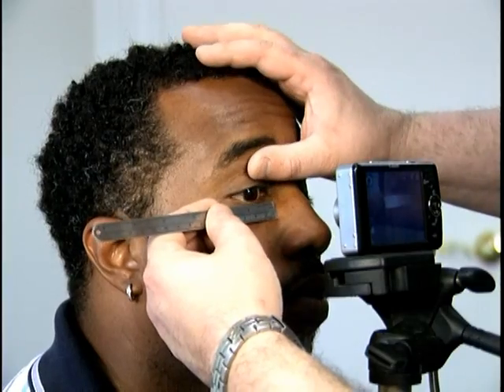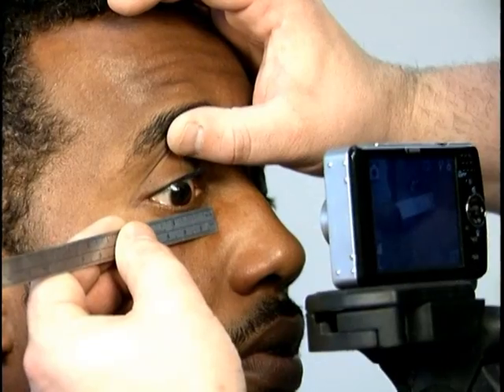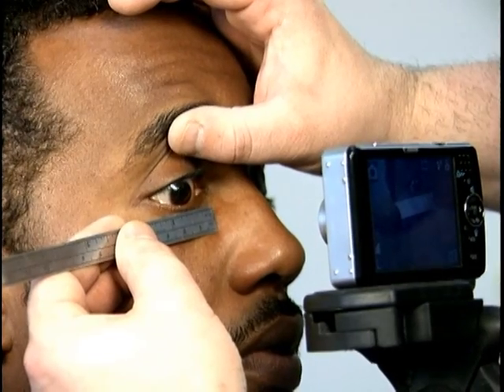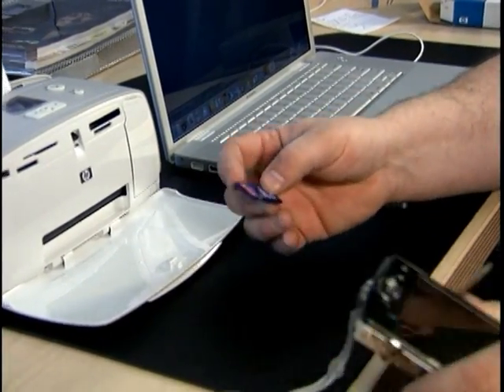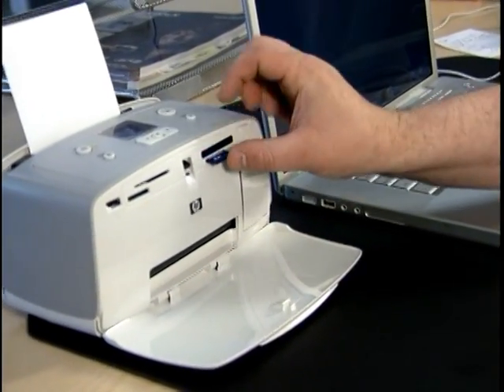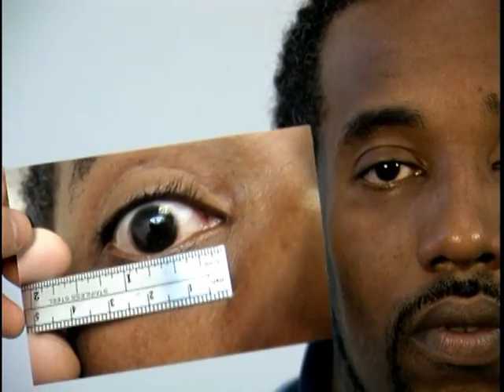Rather than painting the prosthetic with the patient present, a digital photo reference of the patient's eye is taken. The patient's anatomy, including the iris diameter and pupil size, is measured using a ruler. Using a memory card, the image is then transferred from the camera to a printer. After printing, the digital photo is verified with the patient present.